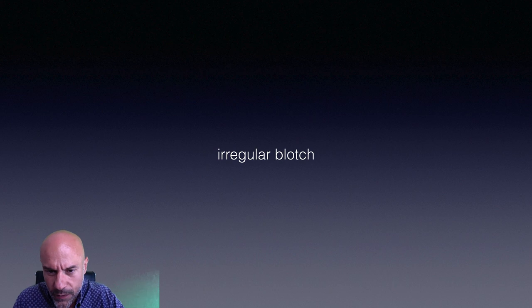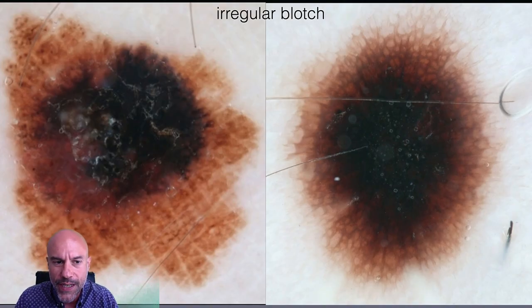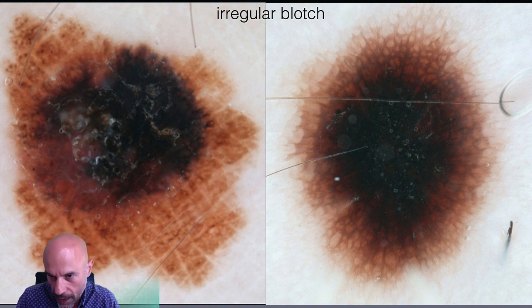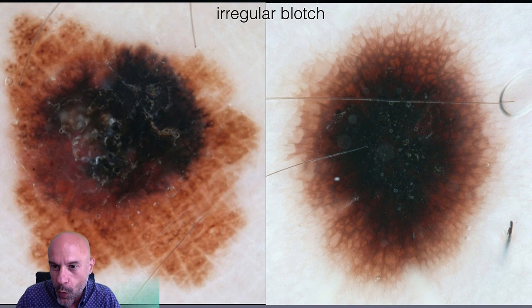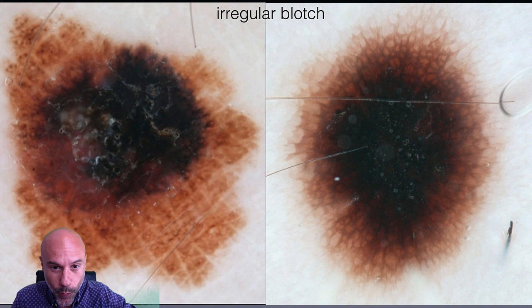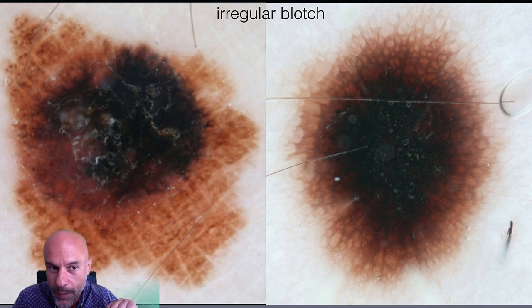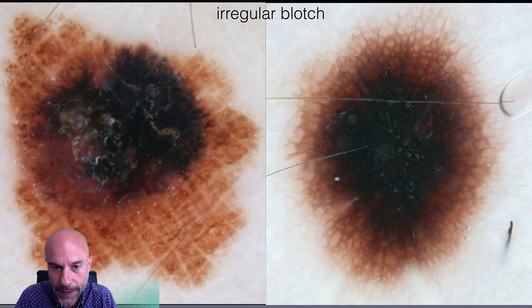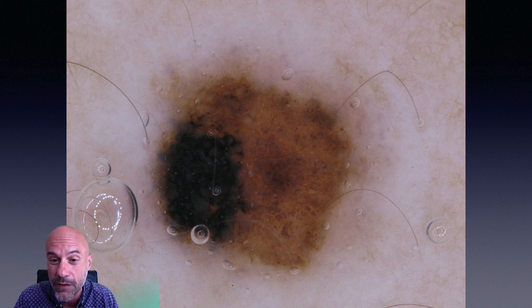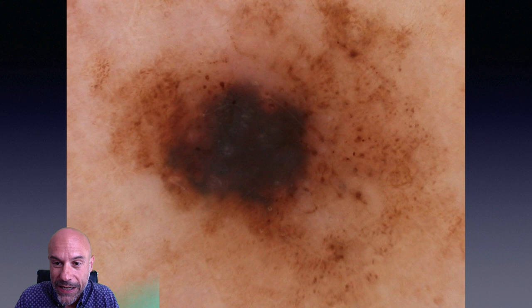The same logic applies to blotch — a black, heavily pigmented area. It is regular when it is central, or if it is all over the lesion. But when it is eccentric, like in the example on the left, it is irregular. More examples: eccentric — irregular blotch, suspicious. Another: eccentric again — suspicious.